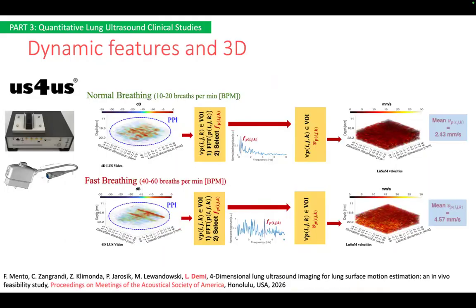Further, we are also now investigating the possibility to extract dynamic features, but in a 3D ultrasound acquisition mode. Here we did for now just a simple test on healthy volunteers that are changing their breathing, and we could see how we can assess variations in breathing. And we plan to move forward with this on clinical studies.